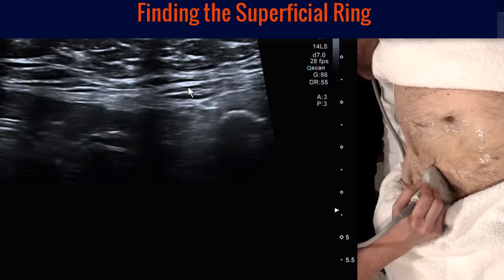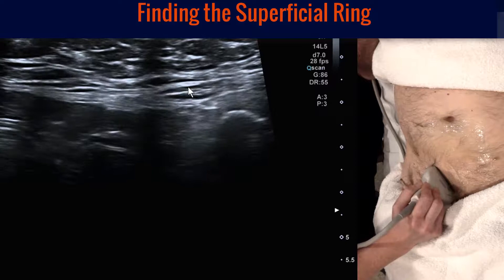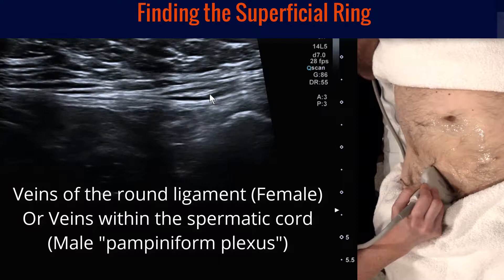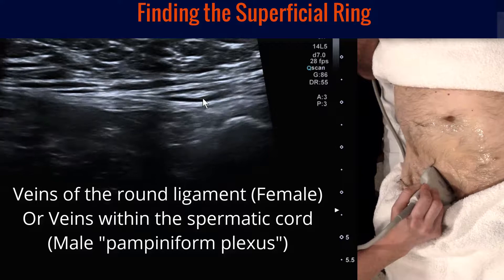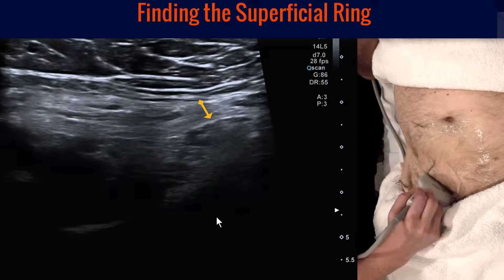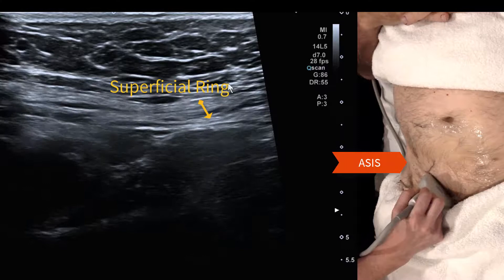Now take the pressure off and move another five millimeters to a centimeter. We're looking for veins - the moment we take our pressure off we can see the pampiniform veins that accompany the spermatic cord or the vas deferens. Once we've found the veins we know we're close to the superficial ring. At this point, rotate the top of the camera towards the ASIS and we can see the spermatic cord and follow the posterior wall of the inguinal canal up towards the ASIS.